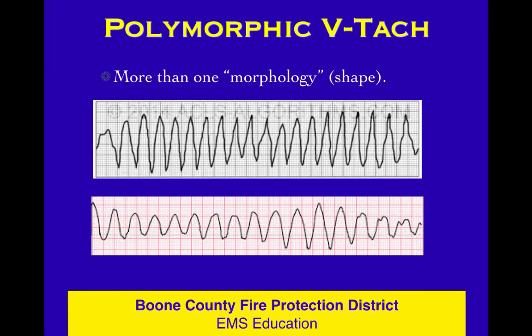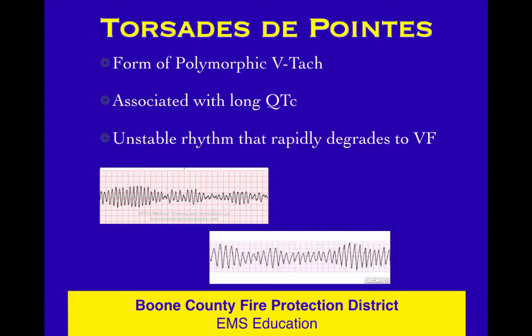Going back, these are all monomorphic VTACs — the same shape every time, only one shape. Now look at this: there's more than one shape, several shapes — that's polymorphic VTAC. It's wide, ugly, and fast. It might be a bundle branch block or an accessory pathway pattern, but it's polymorphic — multiple shapes. A specific version of polymorphic VTAC is Torsades de Pointes, associated with long QTc intervals and treated with magnesium sulfate. It's an unstable rhythm that rapidly degrades into V-fib.